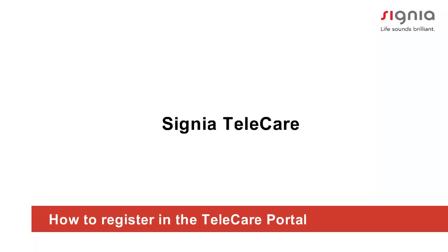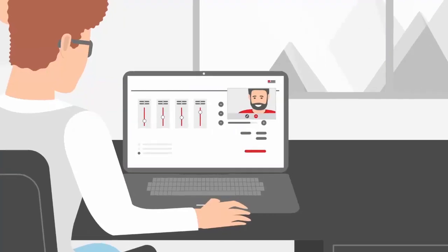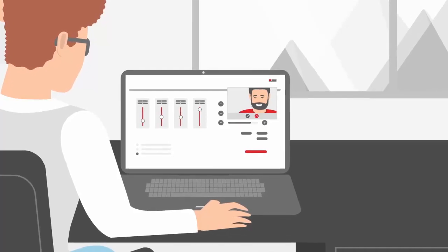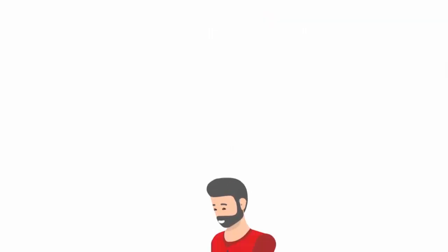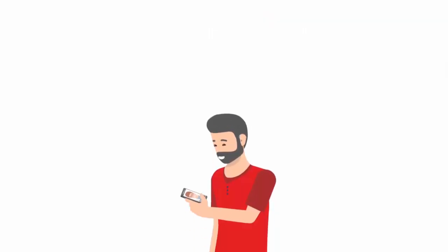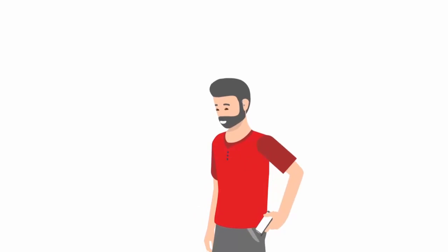How to register in the Telecare Portal. Telecare offers a quick and easy registration process. In this video you will learn how to register in the Telecare Portal.